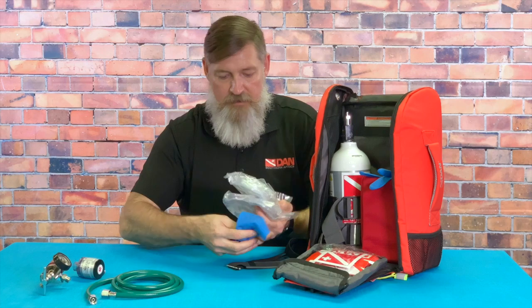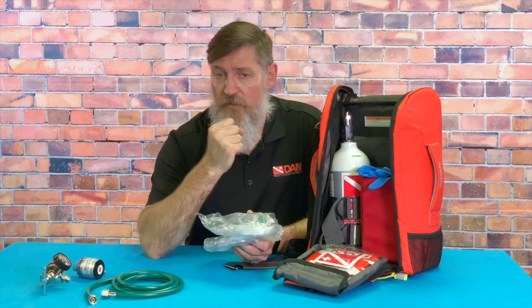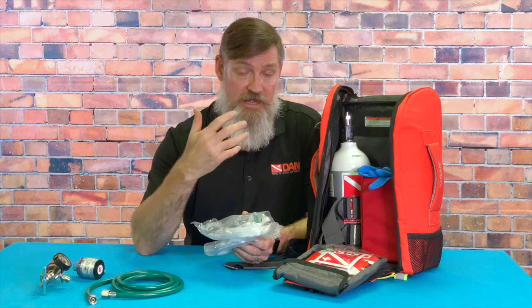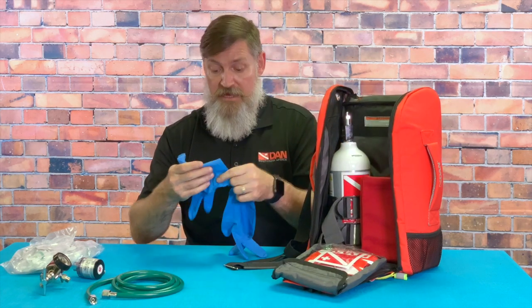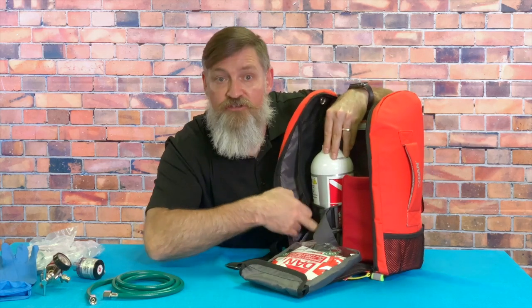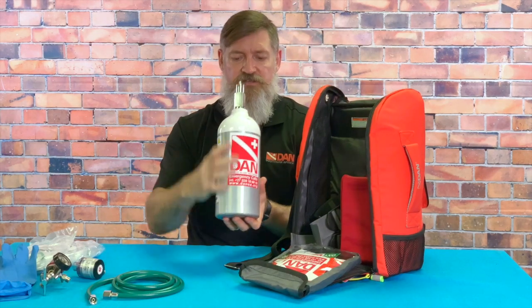It also comes with a number of masks — these are the non-rebreather masks, basically a mask with a bag on. These are ideal for divers that can't necessarily tolerate the on-demand oxygen flow, or if you have two divers, you give the more serious injured diver the on-demand system and the buddy with less injury the non-rebreather mask. You also get gloves — very important to keep clean around 100% oxygen. The small cylinder fastens inside with two straps so it doesn't fall out.